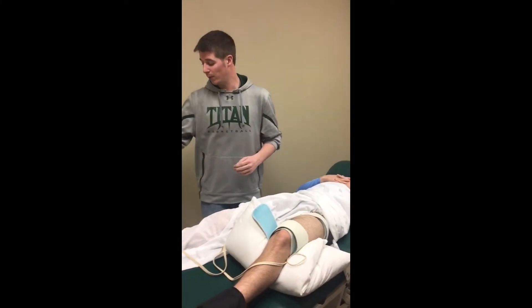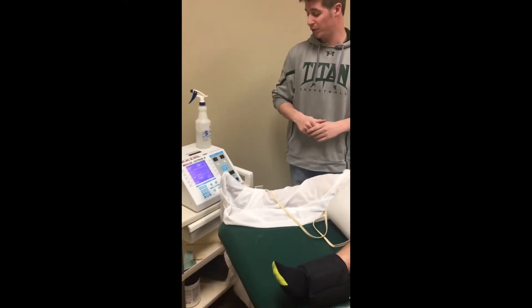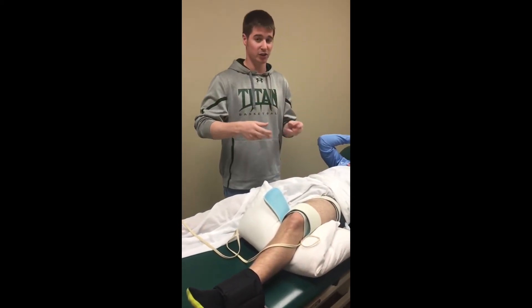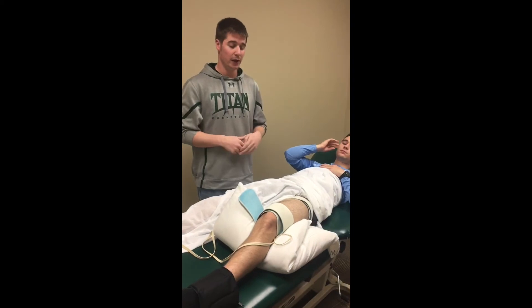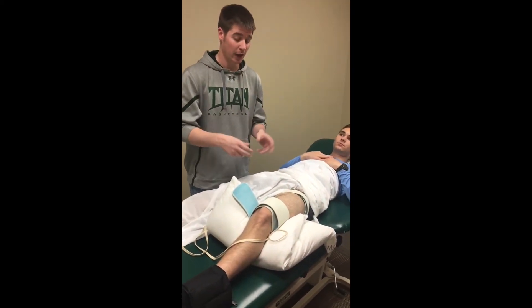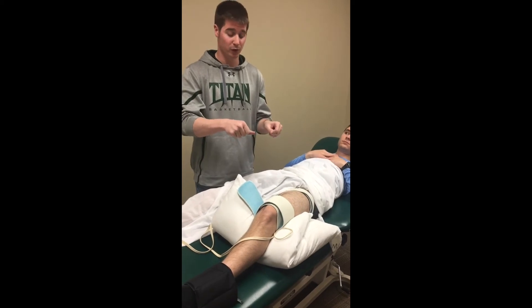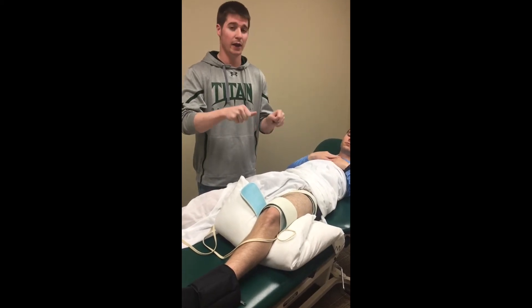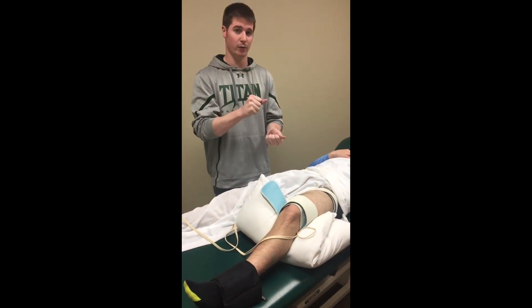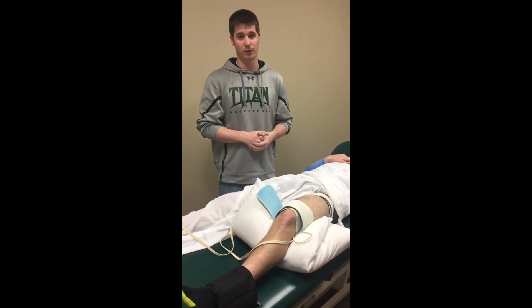For safety, we will ramp up the amplitude before we start the treatment just to get that maximal contraction that is tolerable for the patient. We are going to educate them on what they will feel — how they will first feel the sensation and then feel a grab with both electrodes to get that contraction. Then for the treatment, we ramp it up and ramp it down instead of having it come on right away, just for patient safety as well. Thank you.